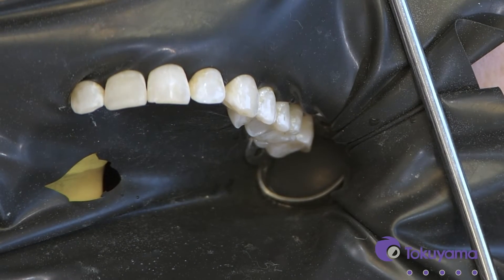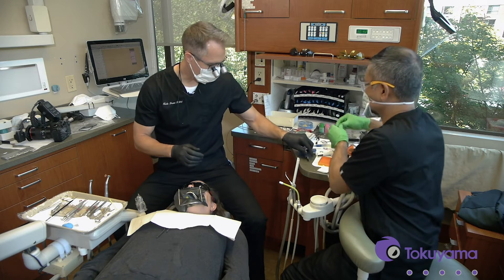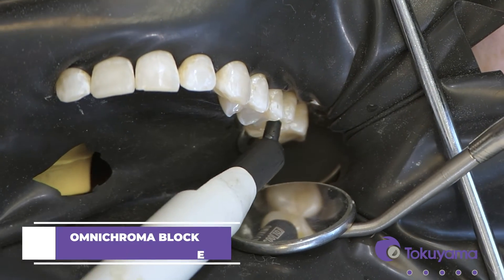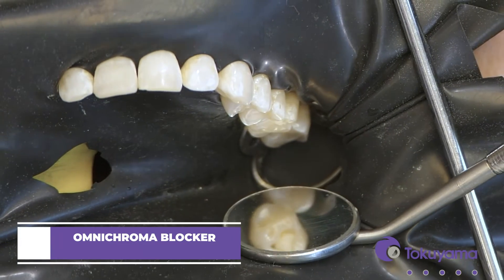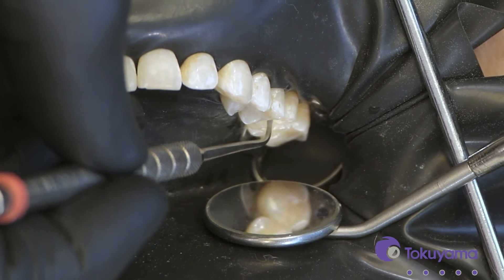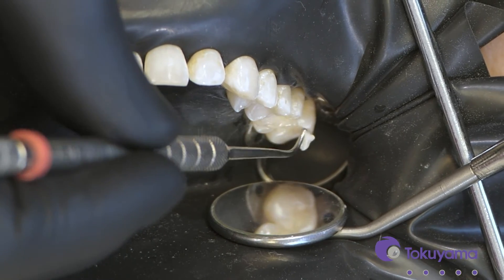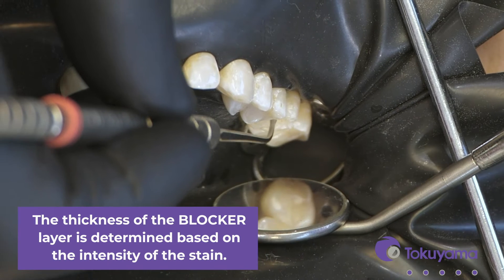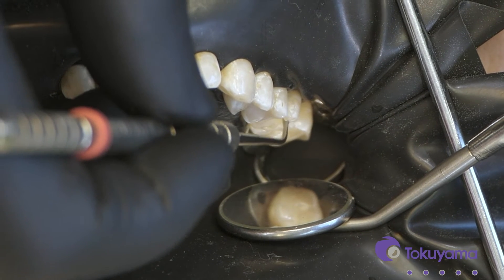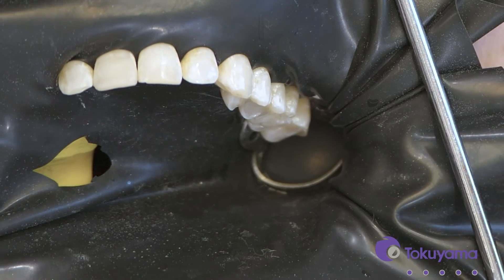From the still photographs you'll be able to see that there's a little bit of darkness down in there — it might be harder to see with the video. This is where I need the blocker. We don't need a lot, but just imagine the blocker acting as a replacement dentin — you're going to be able to hide colors that you don't want to come through. I'm not going to do the whole box with it, but I'll just put a thin coat right over that deepest part in the interproximal box where that darkness was, and just feather it up here onto the rest of the pulpal floor. And that's all you need.